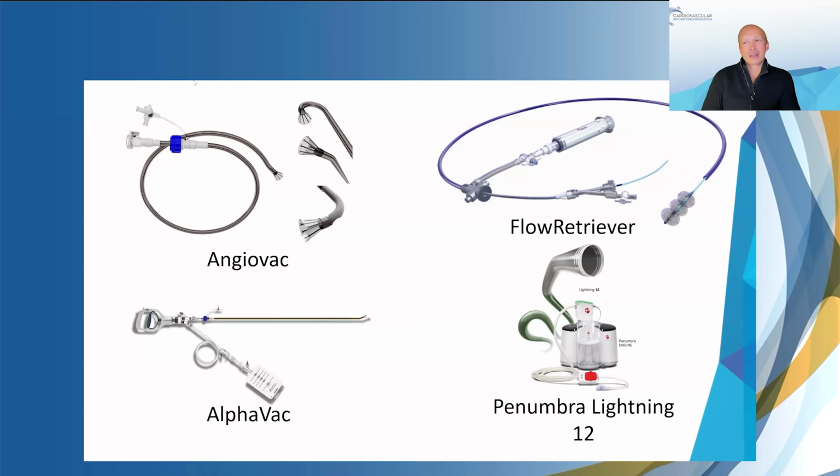I'd agree with you, Abdallah. I think the perfusion requirement, we don't blink at that anymore because we're used to doing ECMOs in our patients. The amount of blood you have to suck off, it's very important to return that to the patient. So having the circuit where you can return the blood to the patient, the AngioVac, I think is really helpful. I also like the steering capability. Nothing is completely perfect in terms of how you want to interact with the valve, because none of these were designed to be valve technologies. The steering isn't exactly designed that way, but I think the AngioVac especially has really good steering capability.